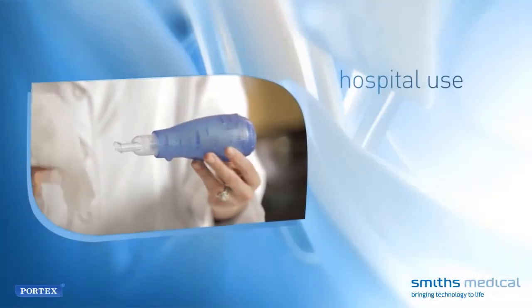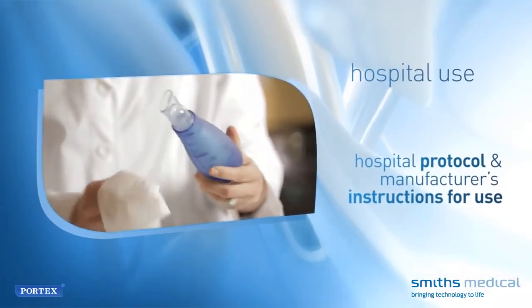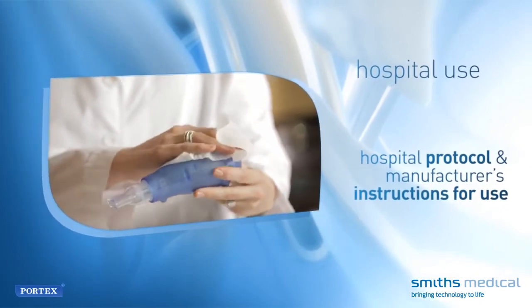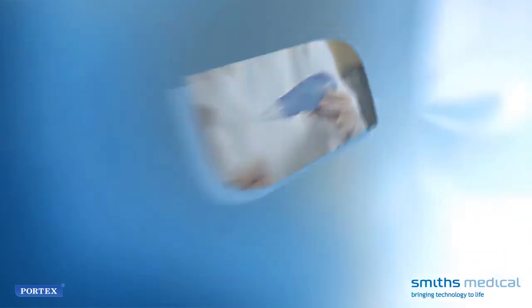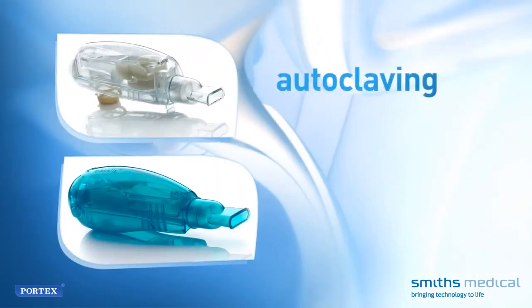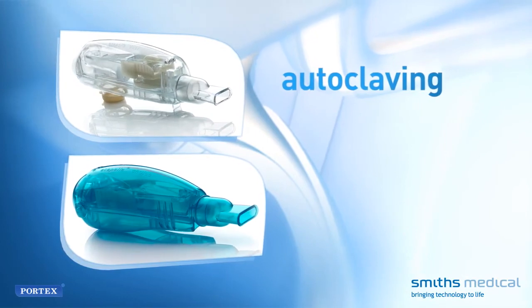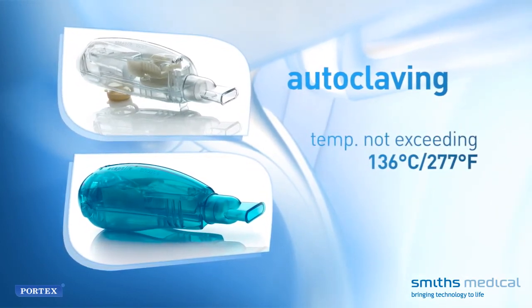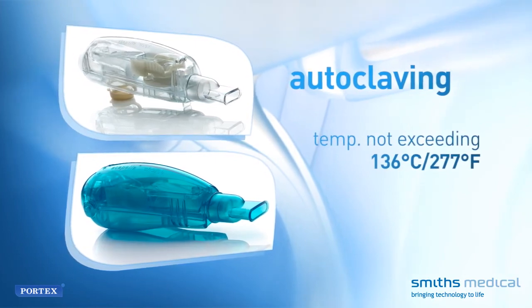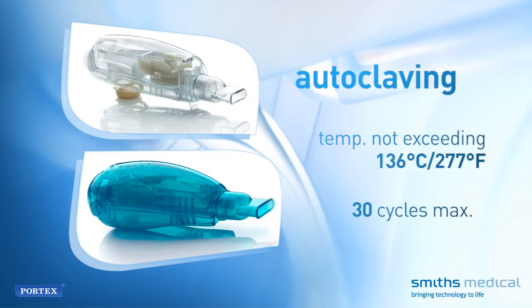Hospital use: Wipe down the device if visibly soiled with a hospital-approved disinfectant that does not contain bleach, or clean and disinfect per hospital protocol for single-use devices. Both Acapella Choice and Acapella Duet will withstand autoclaving. If autoclaving, the temperature should not exceed 136 degrees Celsius or 277 degrees Fahrenheit for a maximum of 30 cycles.